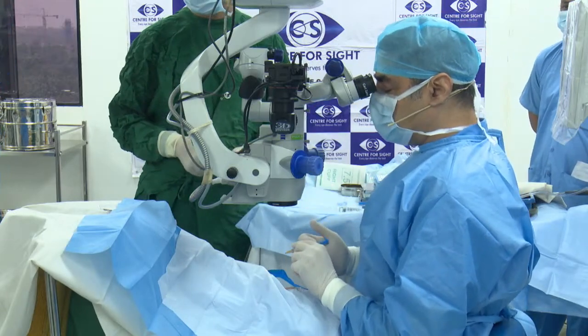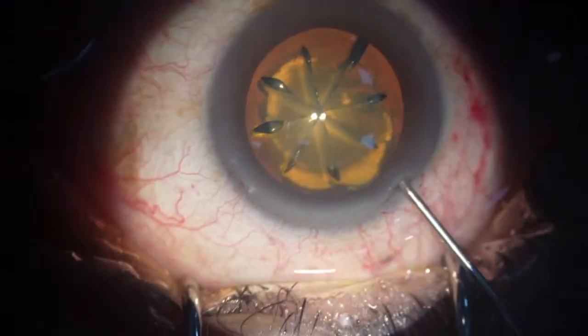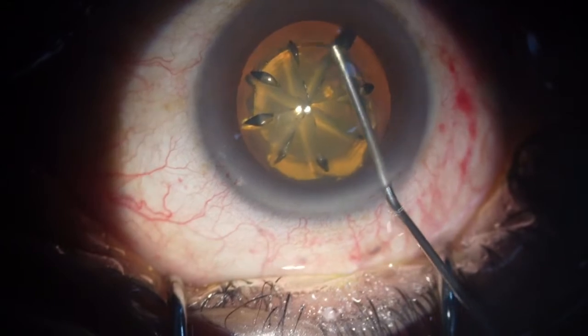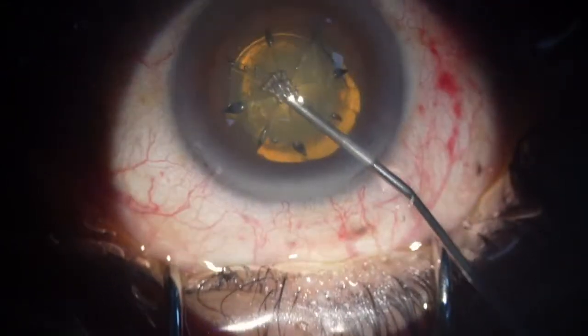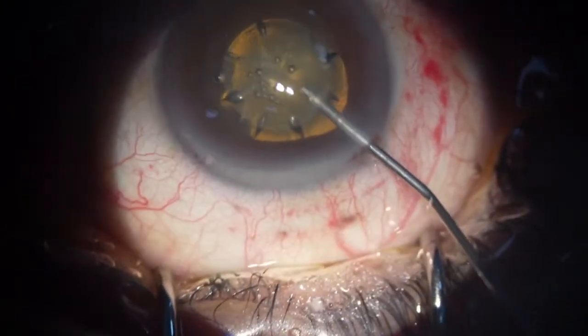Devendra ji, there will be a little burning, I am putting a little medicine. So I will go and do a little bit of hydro here, very gently press it down, and I have a free floating capsule so I don't need to do anything about it.